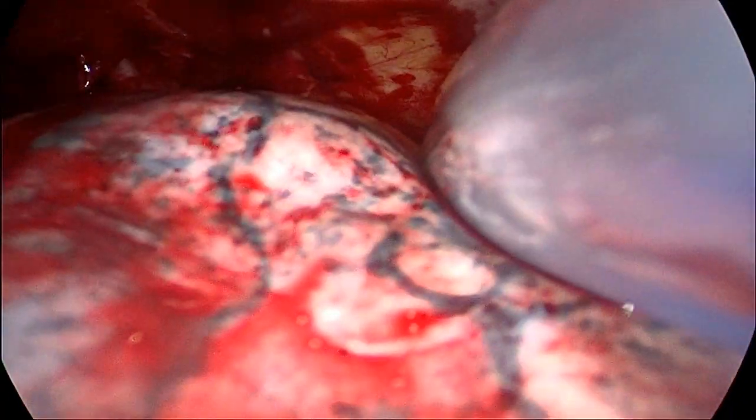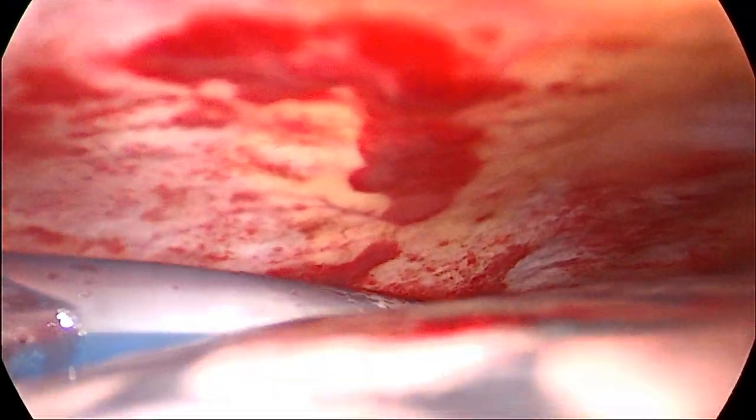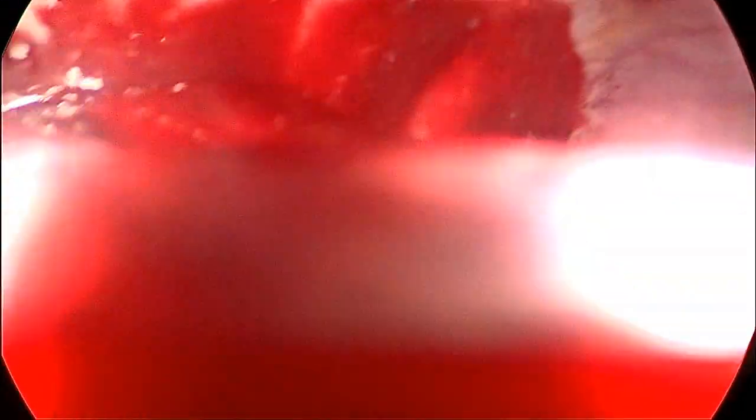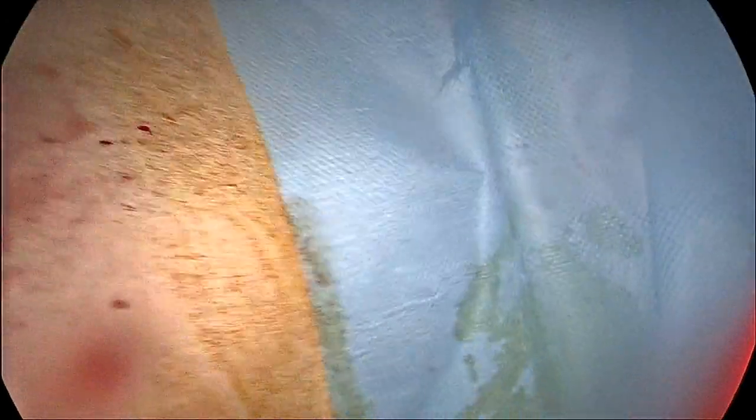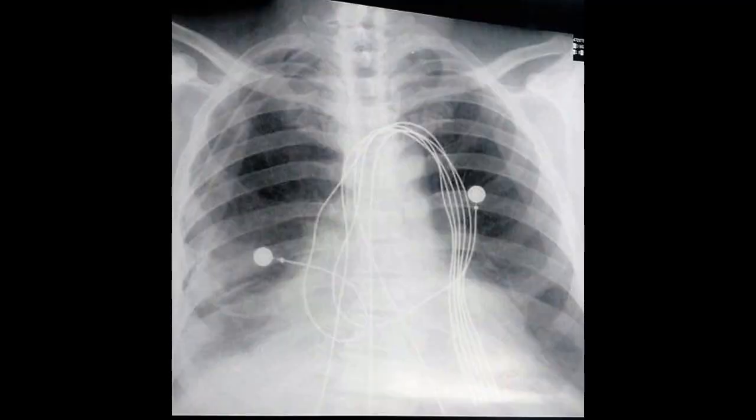Here the lung is now fully inflated, fitting to the chest wall. We place the chest tube at the side of the port, reaching to the apex, then close the wound. This is the post-operative chest X-ray confirming satisfactory positioning.